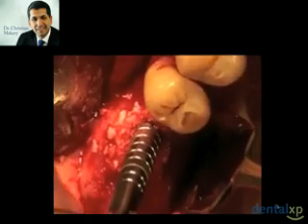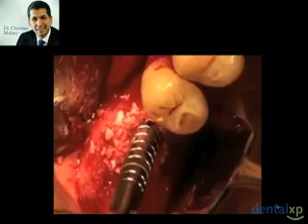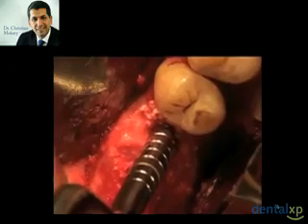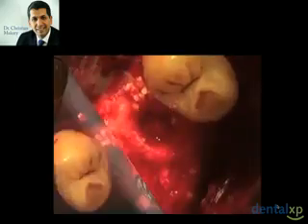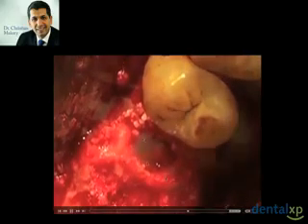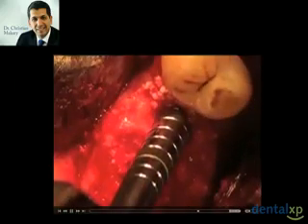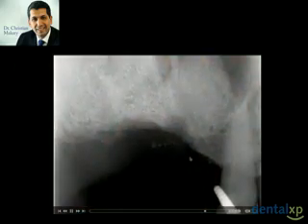And it is a slow technique, you have to add biomaterial and go there millimeter by millimeter, until we reach a proper height of bone graft into the sinus. So you see this is the hole that is performed by the osteotome, this is the added biomaterial, and then by tapping with this osteotome, we lift the biomaterial inside the sinus.